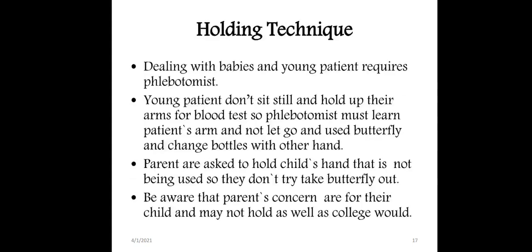Holding technique. Dealing with babies and young patients requires phlebotomists to be skilled. Young patients do not sit still and hold up their arm for blood tests, so phlebotomists must learn to hold the patient's arm and not let go, and use the butterfly and change bottles with the other hand. Parents are asked to hold the child's other hand that is not being used so they do not try to take the butterfly out. Be aware that parents' concern is for their child and they may not hold as well as a colleague would.